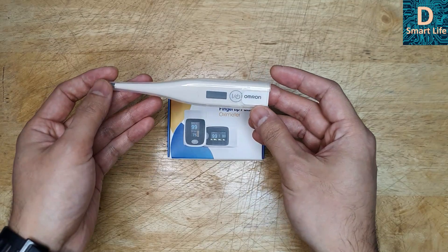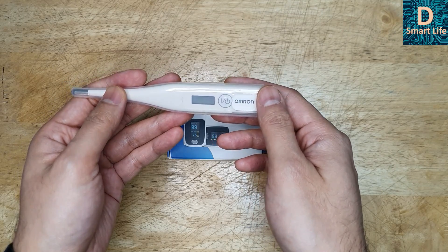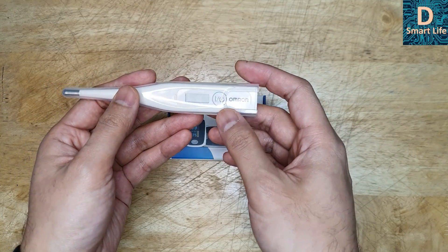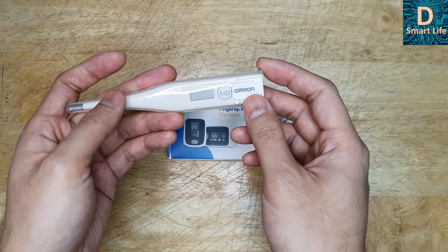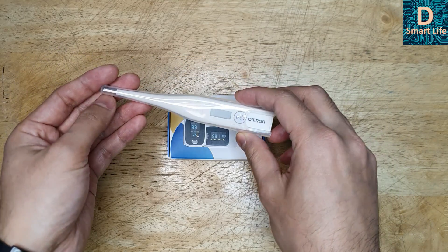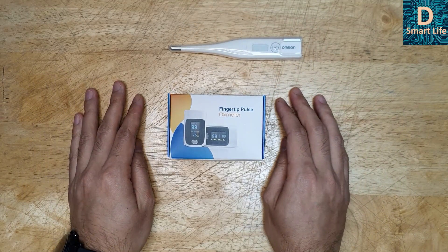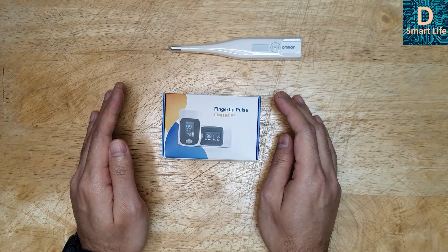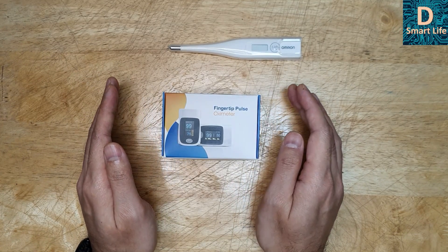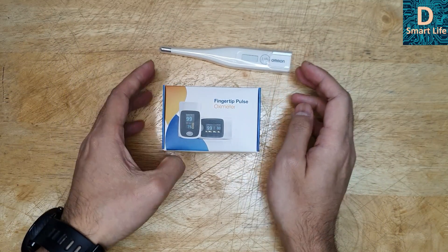The first thing you should have is a thermometer. The classic old thermometer or this new digital thermometer is best. If you have symptoms like fever, cough, breathlessness — the symptoms of COVID-19 — you should always check your temperature. If you have a fever, it may be bad news, but it could also be normal flu, common cold, or other problems. It may not always be COVID-19 unless you have traveled to infected places. Now with community spread rising in many countries, we all have to be careful. The thermometer is not only for COVID-19 cases.